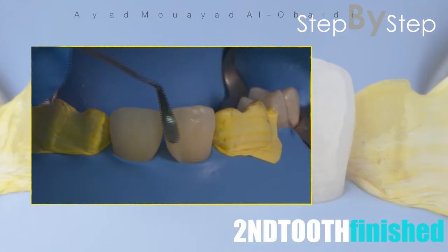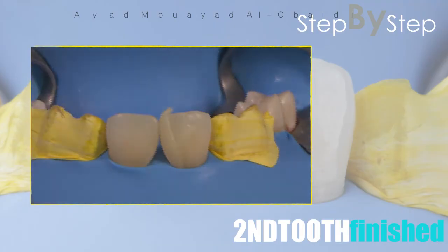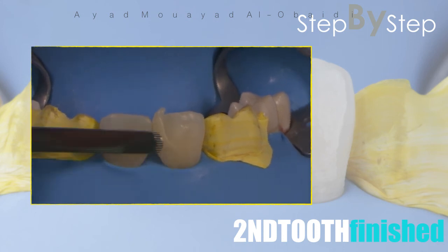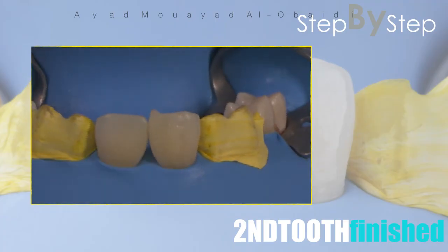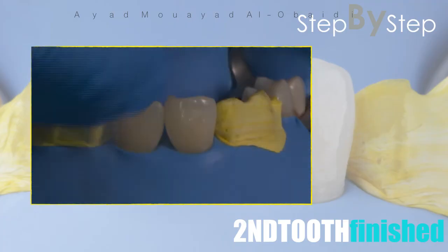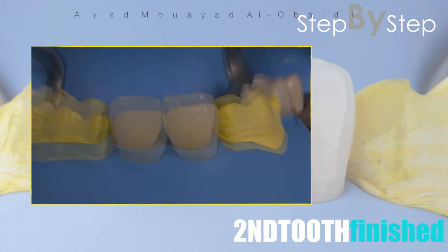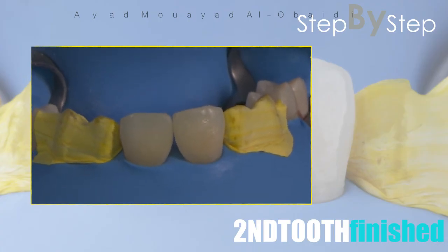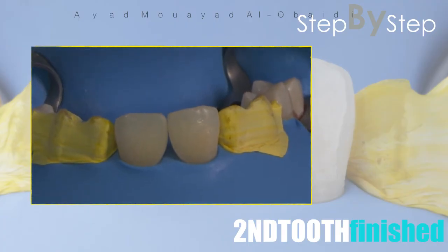A very nice tip here is to use a layer of composite to perform the transition line: apply composite adapted in the proximal wall, then correct it using a spatula and a brush with primer to bring it to the same level as the adjacent tooth. We can also use the Mylar strip to achieve a nice rounded contour.